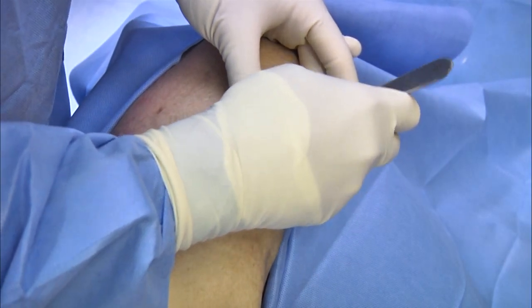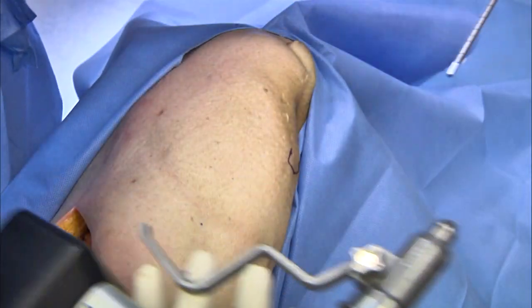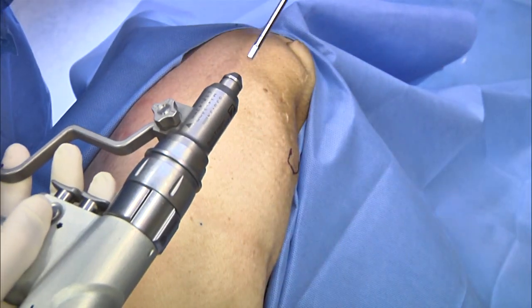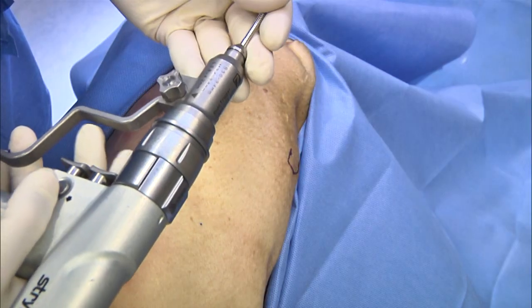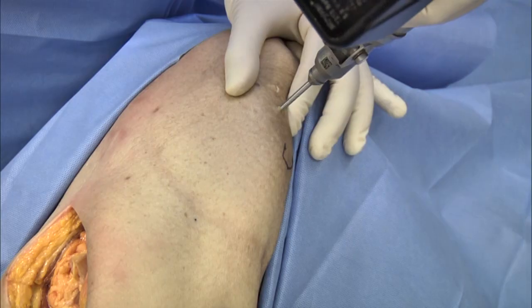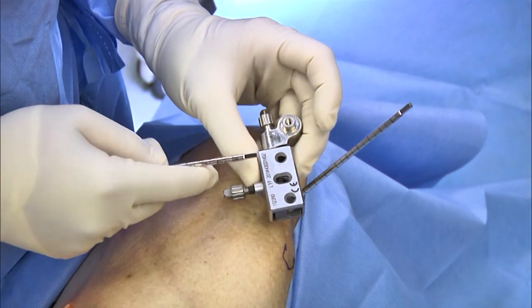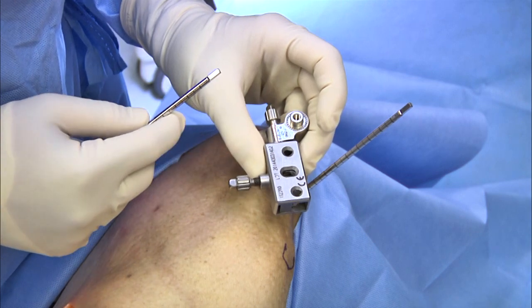Then I'll take a pin, load it up on a pin driver. At a 45-degree angle, drive the pin into the pelvis. I then use my clamp as a guide for the other pins.